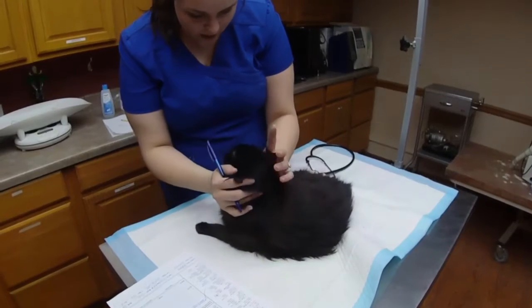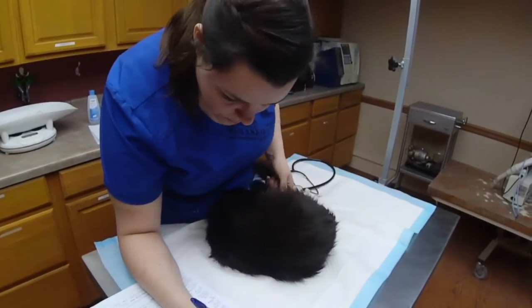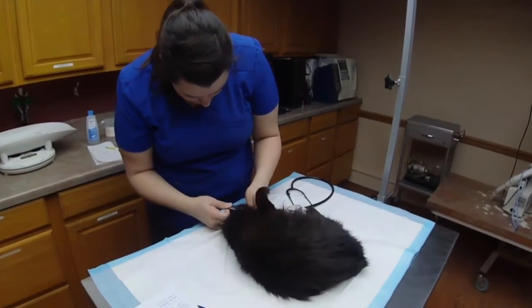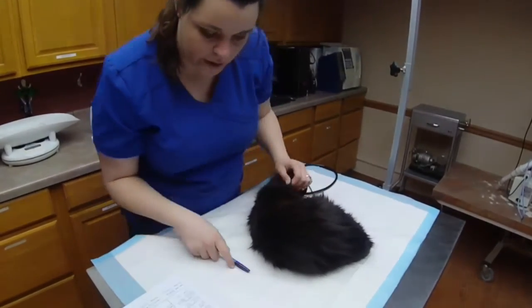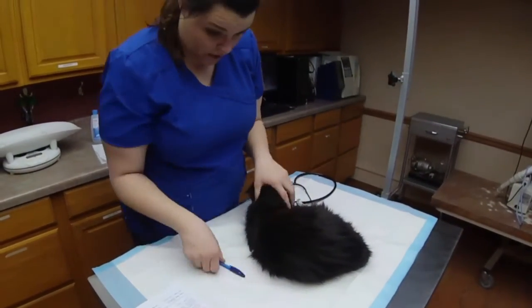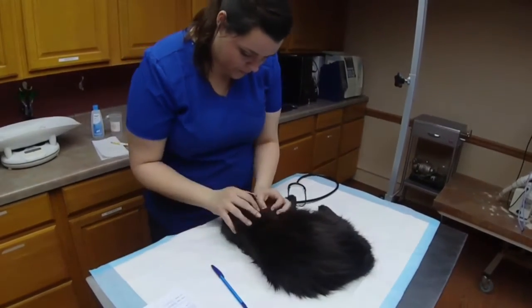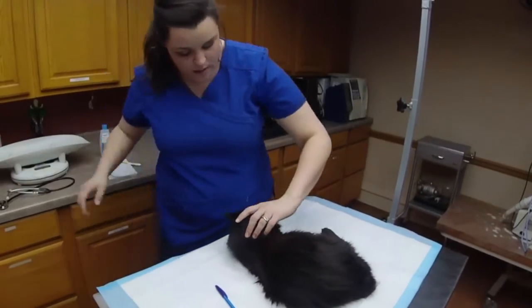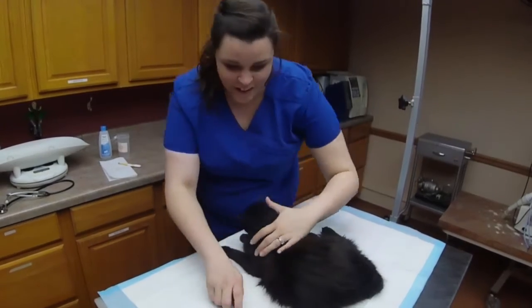Her eyes have a slight discharge on the left side here. Let's see your ears. Her ears are slightly dirty, so we will note that and we will get them cleaned out. Her nose is obviously very, very snotty and has some discharge in it. We will need to do that. Can you see your throat? Yeah, you look good, babe.